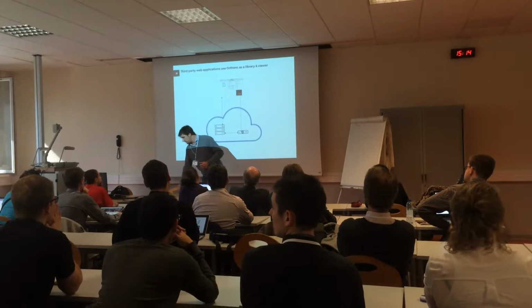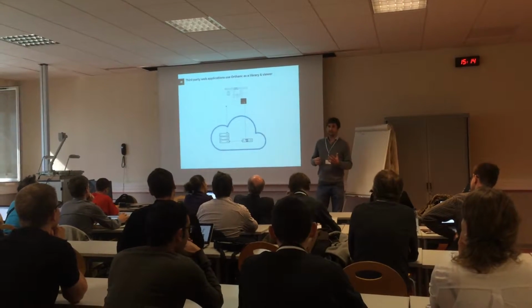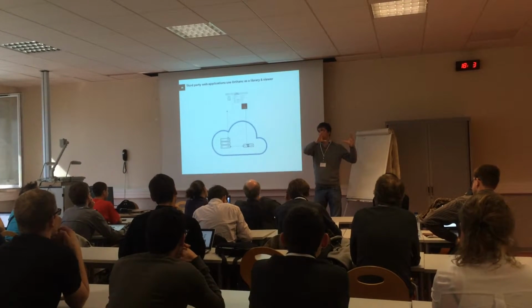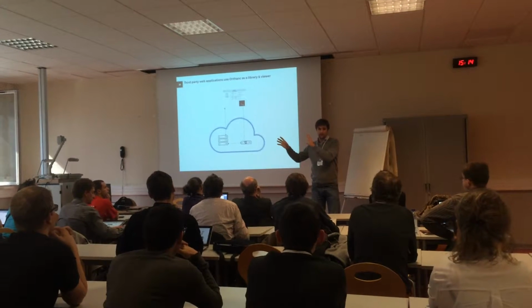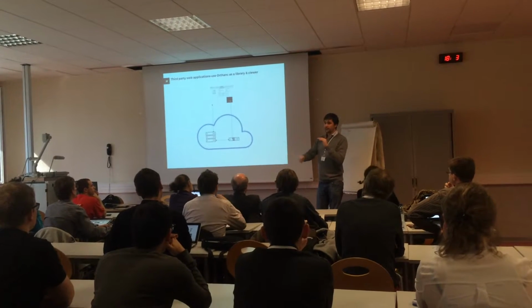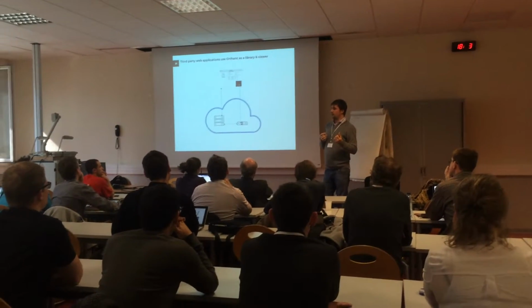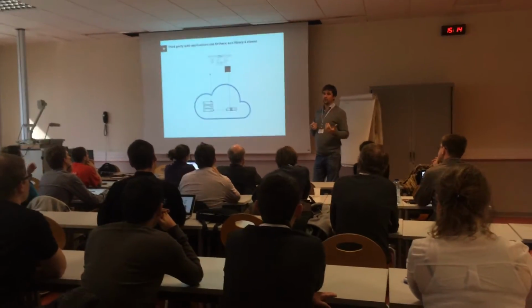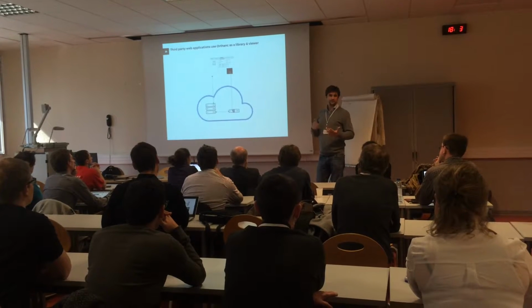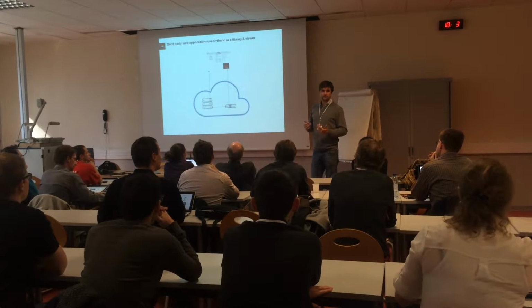And a third-party application that uses Orthanc as a library. So basically, Orthanc, as it's lightweight, can be installed on the cloud. And there's an application running on one hand side and Orthanc running right next to it, actually in the back end. And they can just go and grab images from Orthanc and display them in their app so that they can use it. In this case, it's for a medical case application where specialists have to intervene in order to do expertise research and define what was the cause of an accident or something like that.